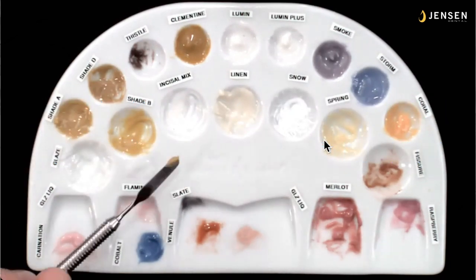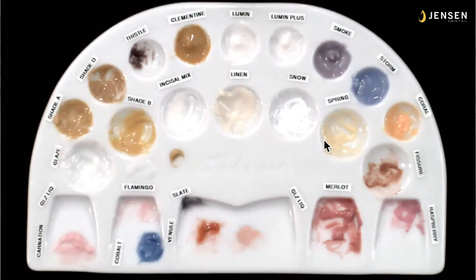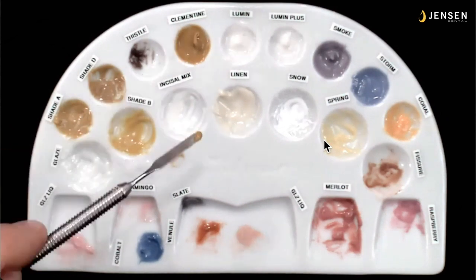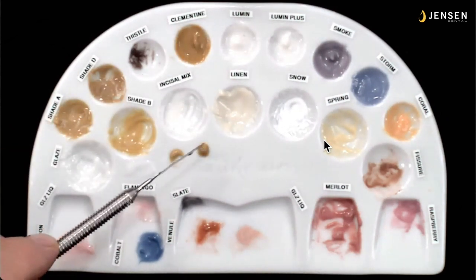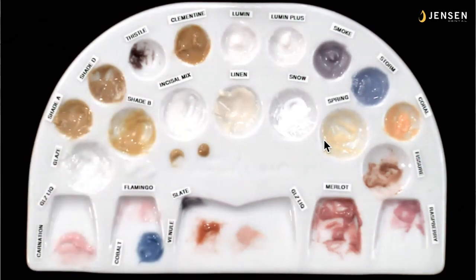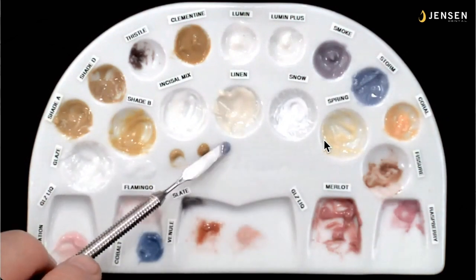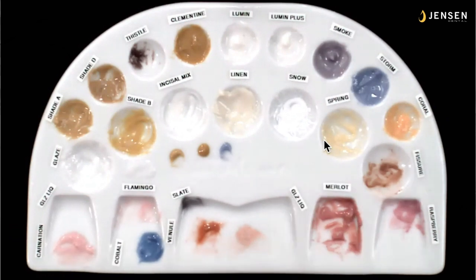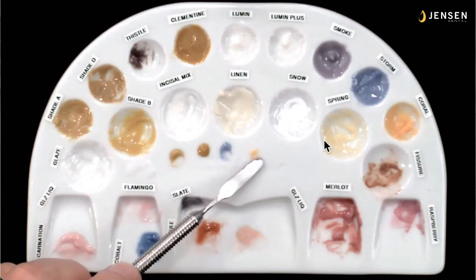Okay, I'll dispense with a metal spatula, but with mixing, it's a whole different animal. So I get a little bit of my shade A there. I like to get a little bit of Clementine, and I'm just wiping it off with a tissue in between. No big deal. And again, all these are about the consistency of honey or molasses. I never get it thinner than that in the wells because it'll fall out of suspension if you get it too thin. I'll get these little bits that I'm dispensing here, and this is about the size of a hole punch piece of paper, like if you're punching holes in notebook paper.